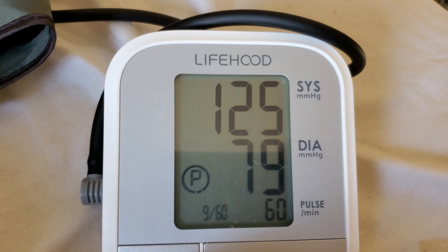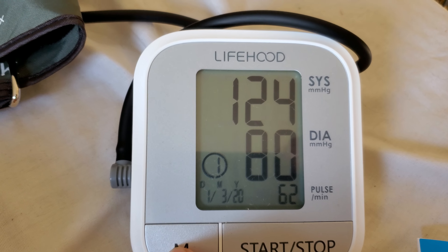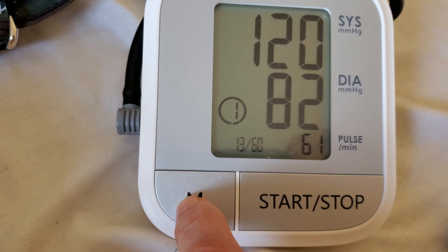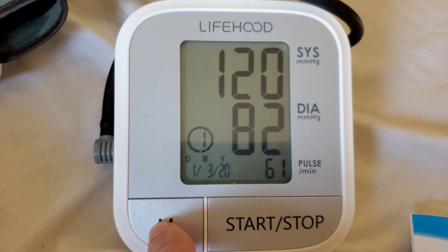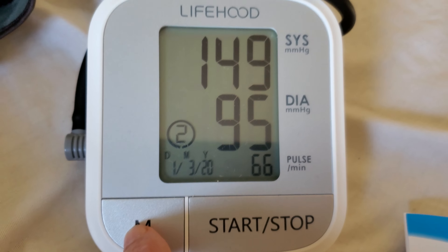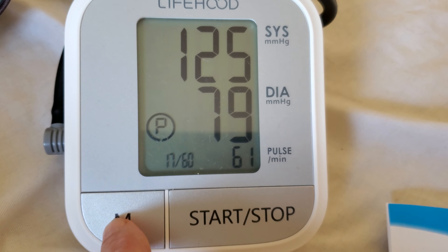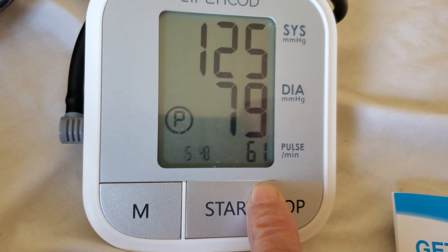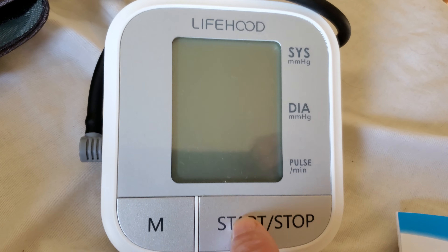It's got the date down there too — the time I set it — so it tells you what day each reading was. You turn it off and on like that, and start a reading.